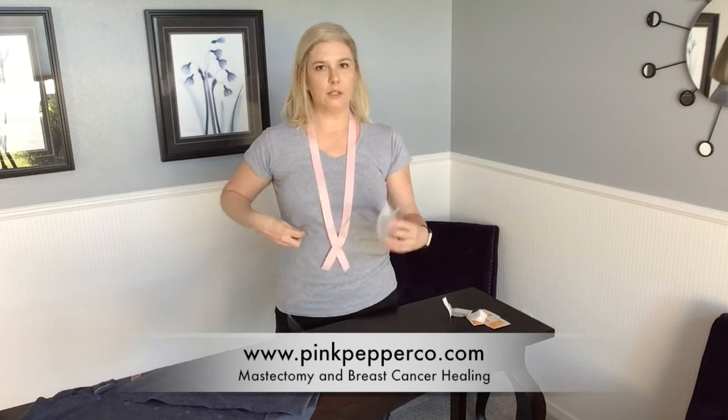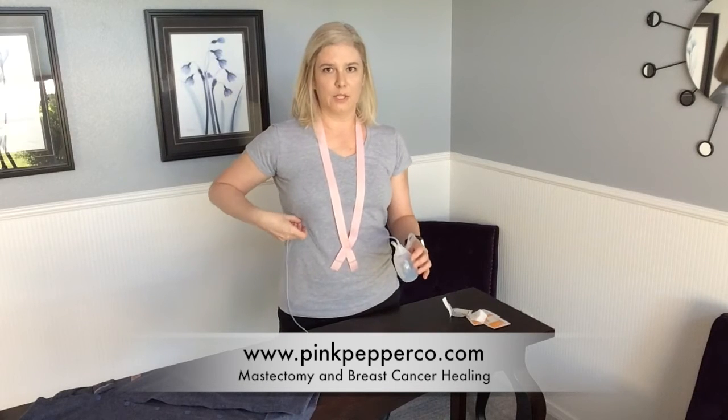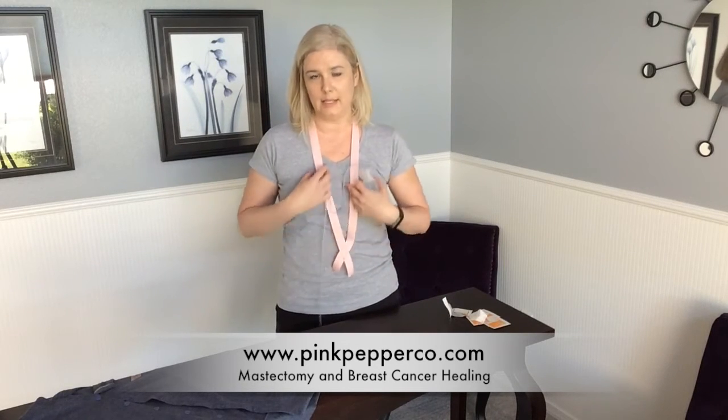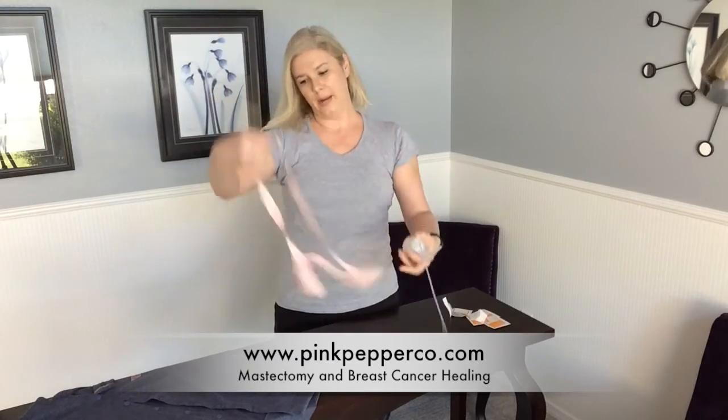And also, you can't just leave these hanging. It's just one little stitch that's attached to it, so you have to always have it somehow contained. So for the shower, this ribbon is great.